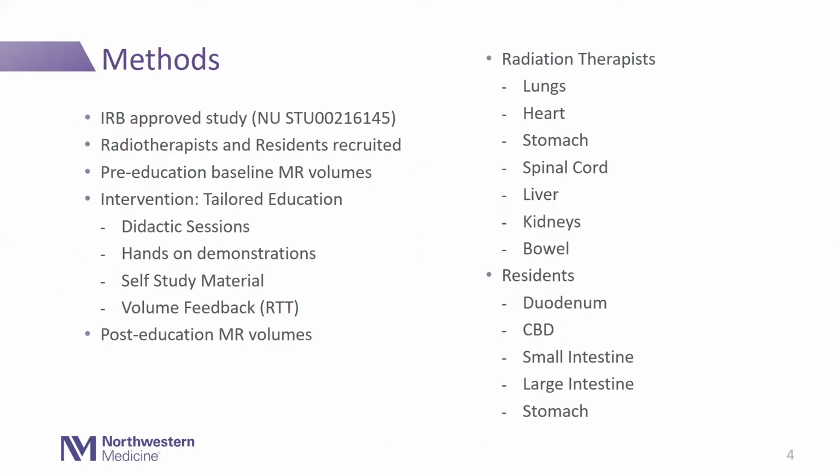So our methods, this was an IRB approved study at our institution. It recruited radiotherapists and residents. There was a pre-education baseline MR volume where we gave a few series to both radiotherapists and residents and had them do volumes before they learned anything about abdominal imaging or radiotherapy on MR-Linac. And then the intervention itself was the tailored education that was specific to either radiotherapists or residents.